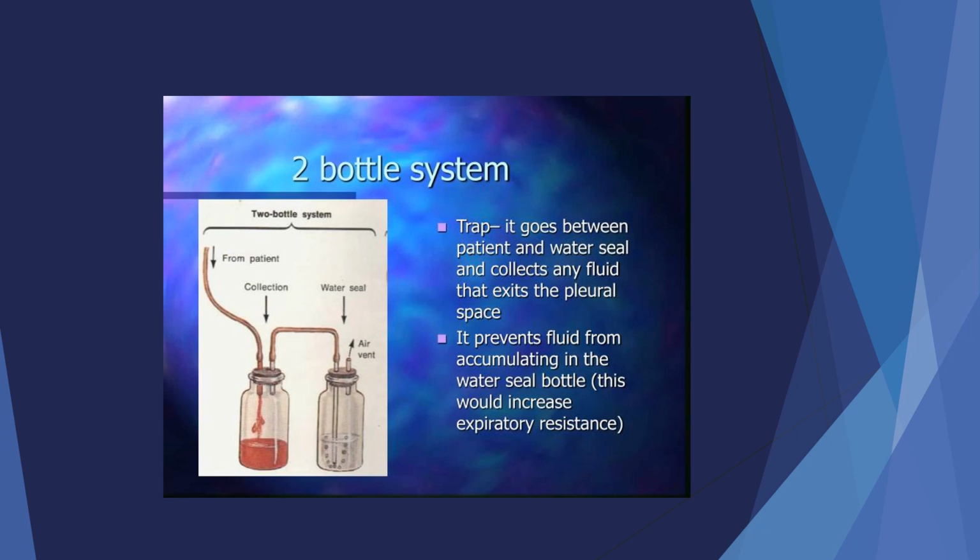2 centimeters, looks like right there. And what this is going to allow to happen is any fluid in the chest to drain into the collection chamber, but yet it's going to allow the air to pass through.